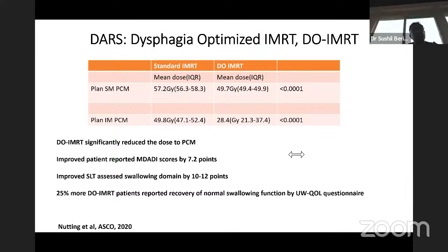Now, I didn't answer the question for conformal radiation therapy, IMRT and VMAT. VMAT is preferred just because of ease and convenience of dose delivery. The dose distribution looks very similar, although some studies say VMAT has better plan. But that being said, we prefer VMAT just because patient is on the table for shorter period of time. You can be done faster. When you're optimizing on IMRT or VMAT, in the older software, the hotspot used to be 115 to 120%, but the newer software and hardware, your hotspots are usually less than 110%.